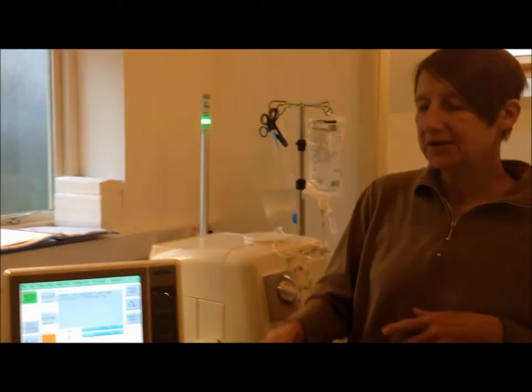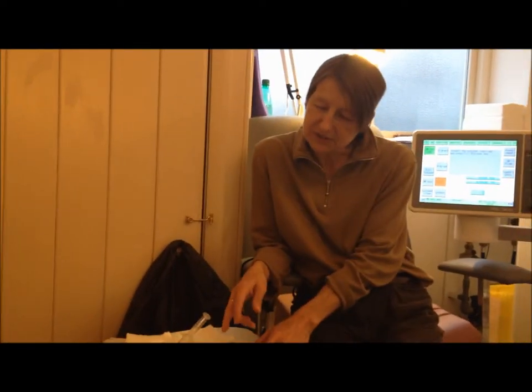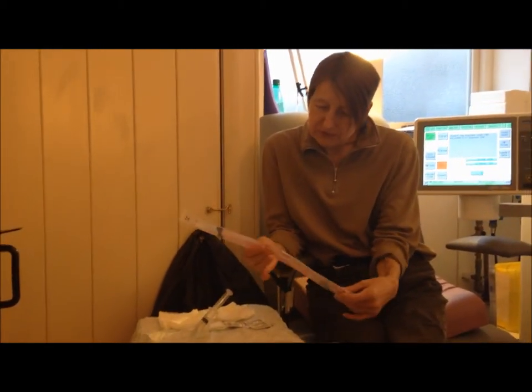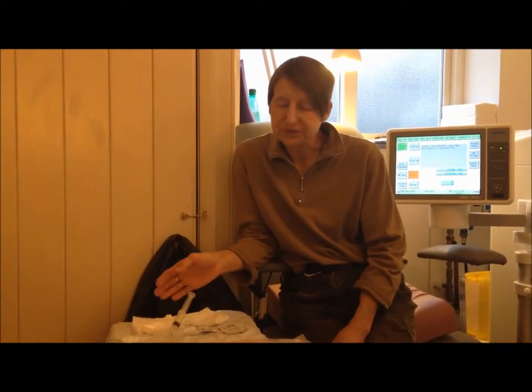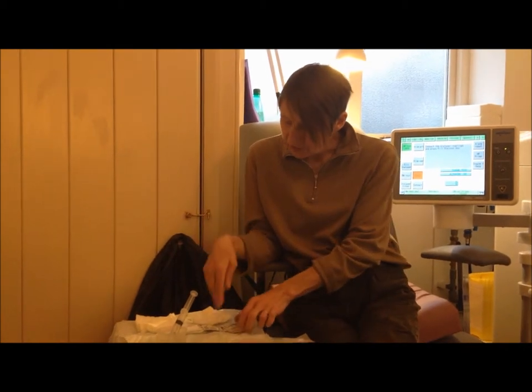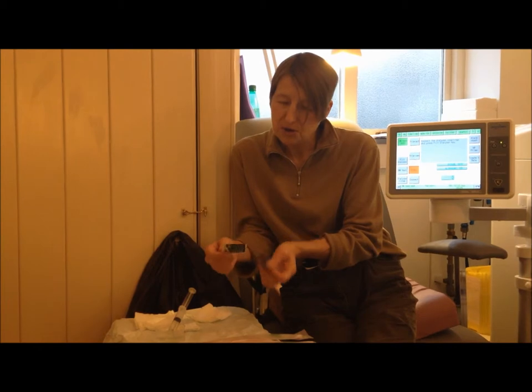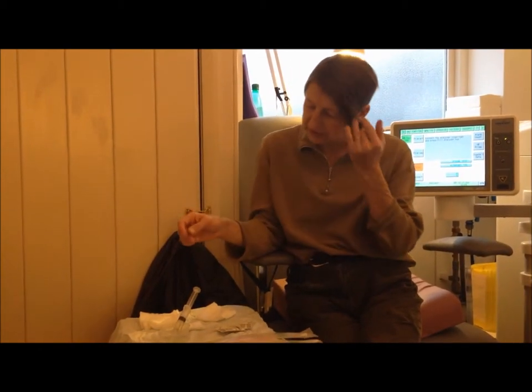Over here on this little trolley are all the bits and pieces that are needed to connect me up to the machine. These are the needles that are used. We've got a syringe here — lots and lots of syringes are used in dialysis. We've got these pinnacle wipes; two wipes are needed for each dialysis session.